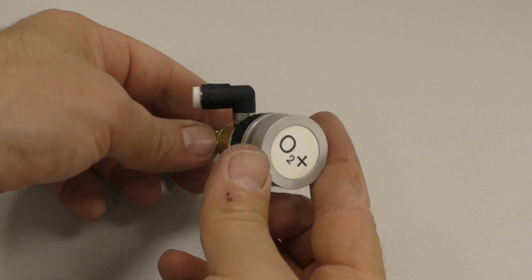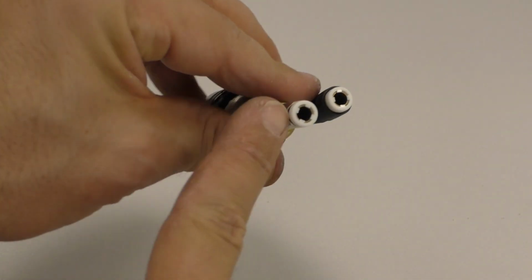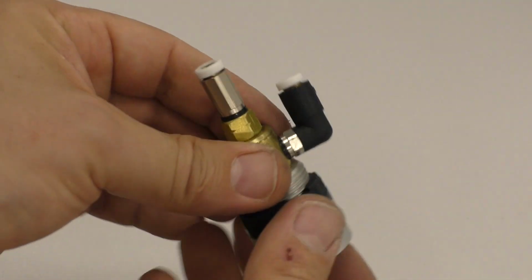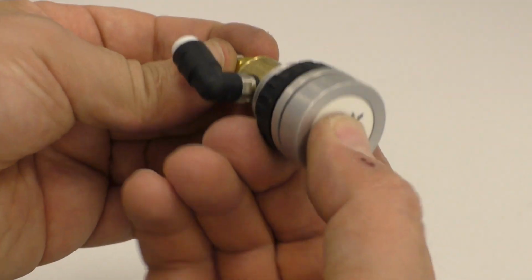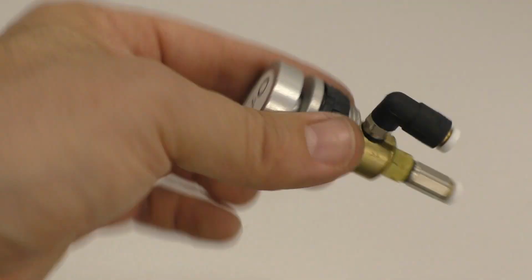Okay, last part salvaged. A pneumatic button. Input, output, or the other way around. You push it, it comes out what you put in. Okay. I don't know where I can use a pneumatic button, but that's one.